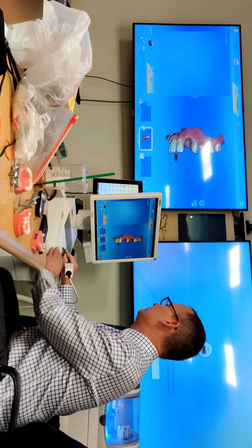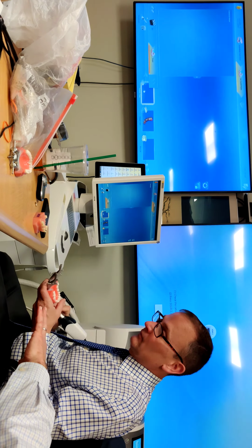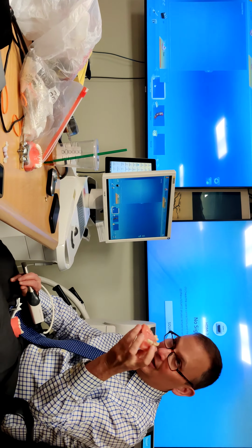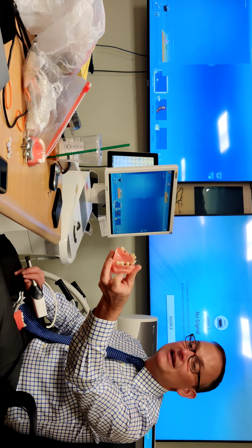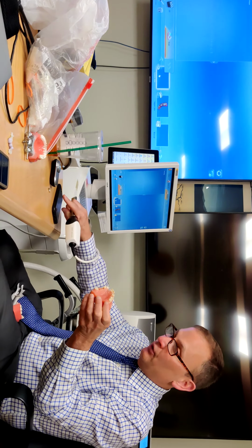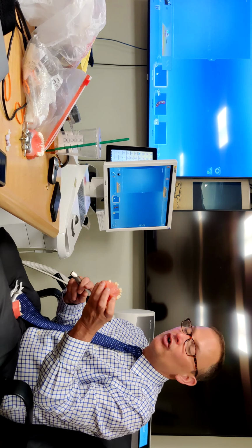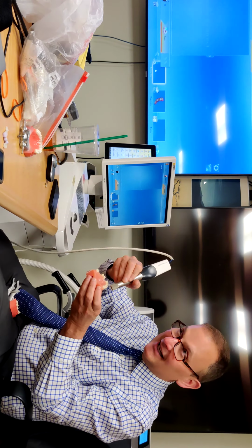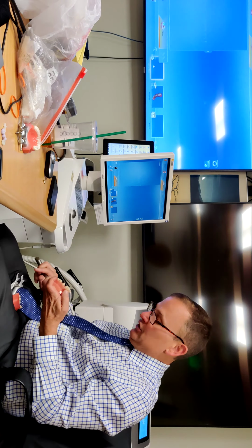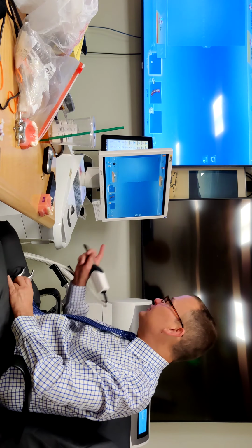Why did you scan that? Look, we're sending this to Atlantis for an abutment. The fixture's already in. So I scanned it without the scan body, without the impression piece, without the intraoral scan body in, because I can get the contact. If I have that in, I can't get the contact. Everybody get it? Do you have to leave the healing abutment in, or do you take it out? I take it out, because I want the tissue in that scan.